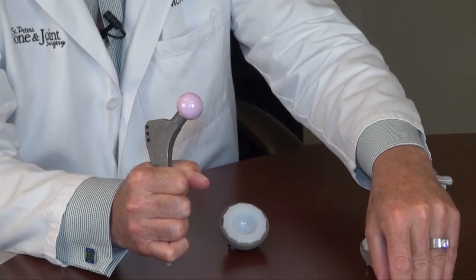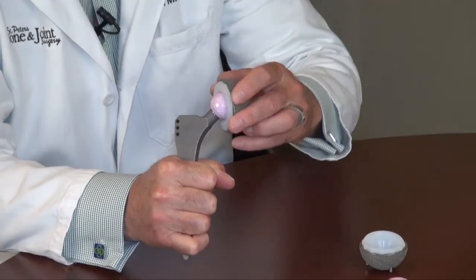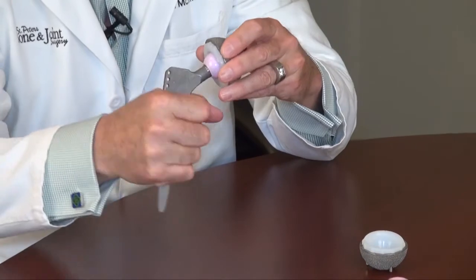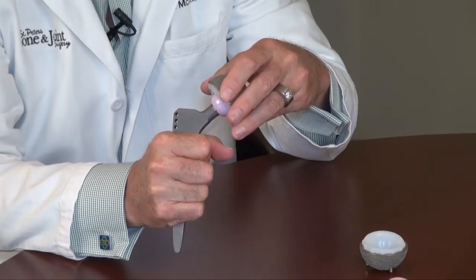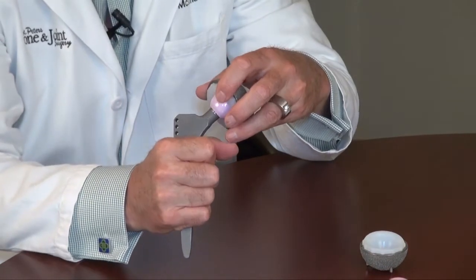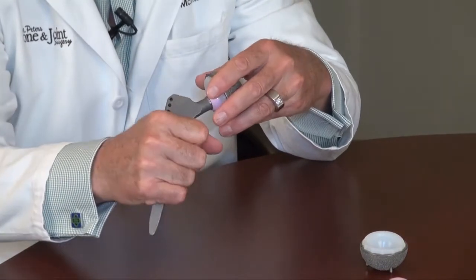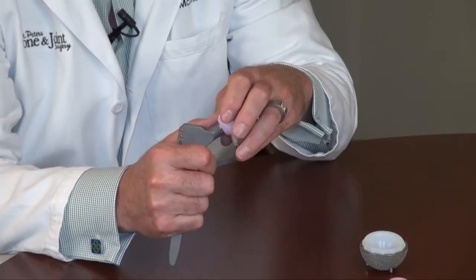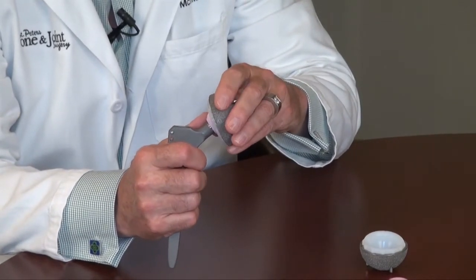So the ball then fits into the socket, so when you walk, all the movements occur between the ceramic and the plastic here. There are no nerves in ceramic or plastic, so that's what gets rid of the pain. Basically, you can walk without pain, and it allows for good range of motion as well. We hope these hips will last 30 or 40 years. There are some risks of hip replacement.